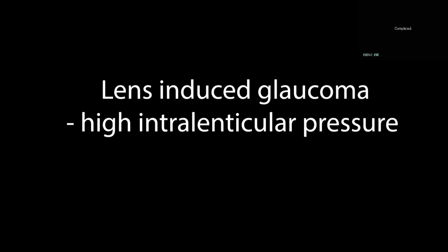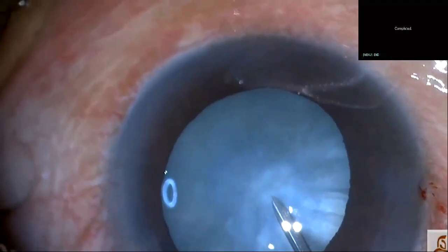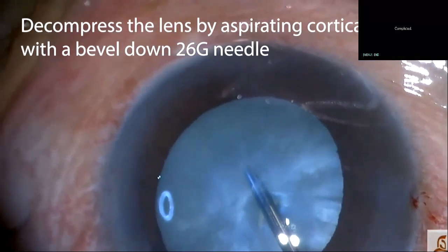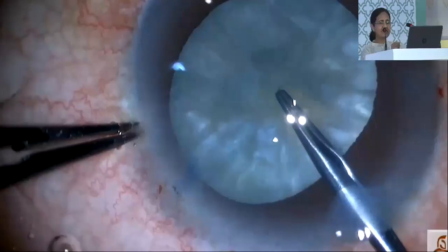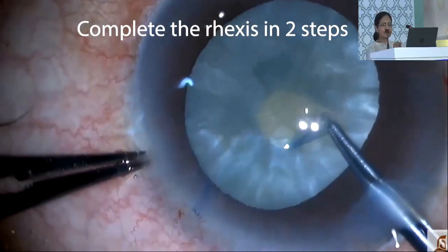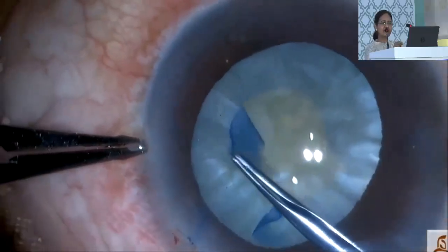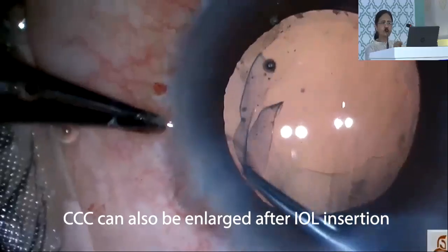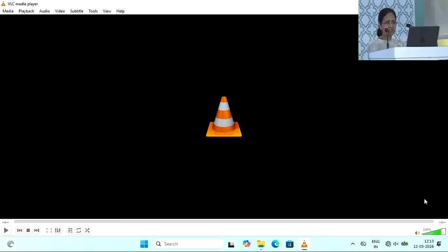Now in a lens-induced glaucoma patient, there is high intralenticular pressure. So first, preoperative mannitol injection, of course, you have to give. We puncture the anterior capsule with a bevel down 26G needle, suck in the liquid cortex to decompress the bag, and then we extend the rhexis with a forceps. The rhexis is made in 2 steps. First we make a small rhexis, then we enlarge it, so that the bag is thoroughly decompressed. Also, after the IOL insertion, if you see the rhexis is small, you can further enlarge it. Thank you.